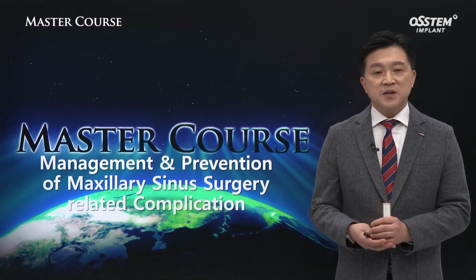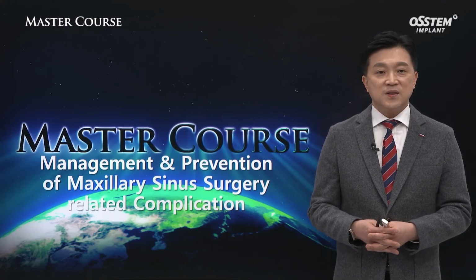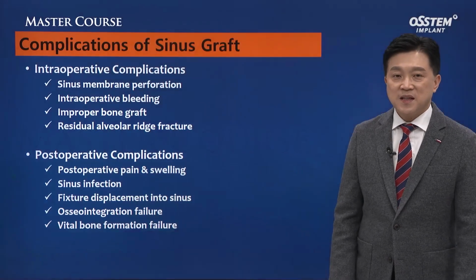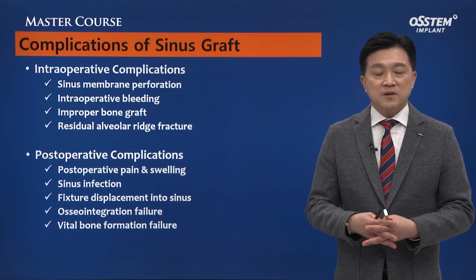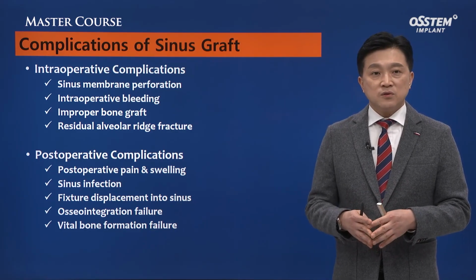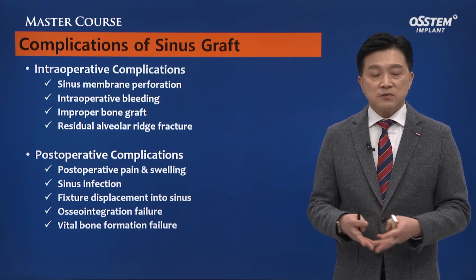Today I want to talk about management and prevention of maxillary sinus surgery-related complications. The complications of sinus graft can largely be divided into two, intraoperative and postoperative complications.